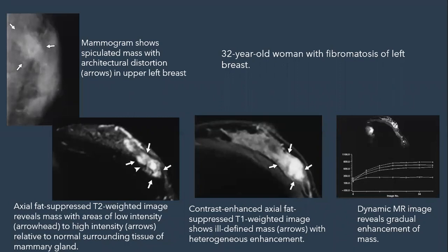Does the patient have what? Even for you, Dr. Muawiyah, you have done plastic surgery. Yeah, those who have other lesions in other parts of the body. Like where? Family history. Yes, you are right. Other part where exactly?